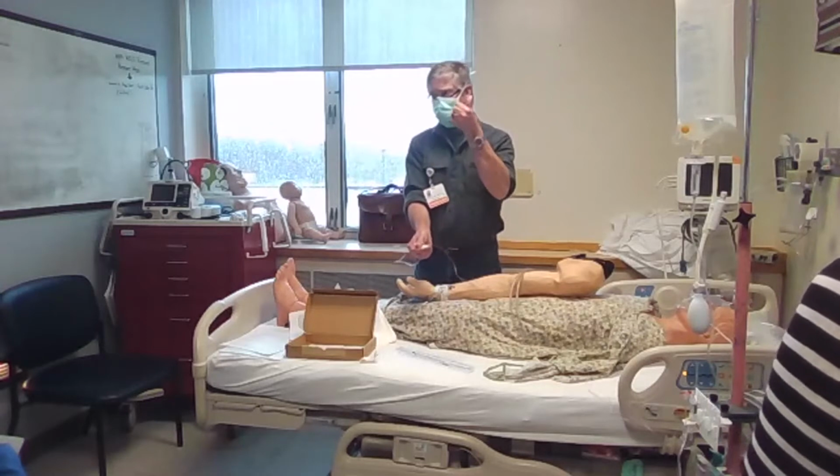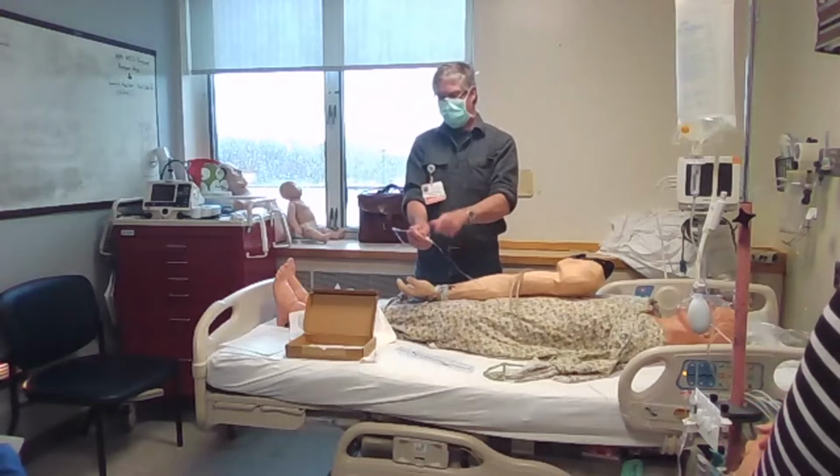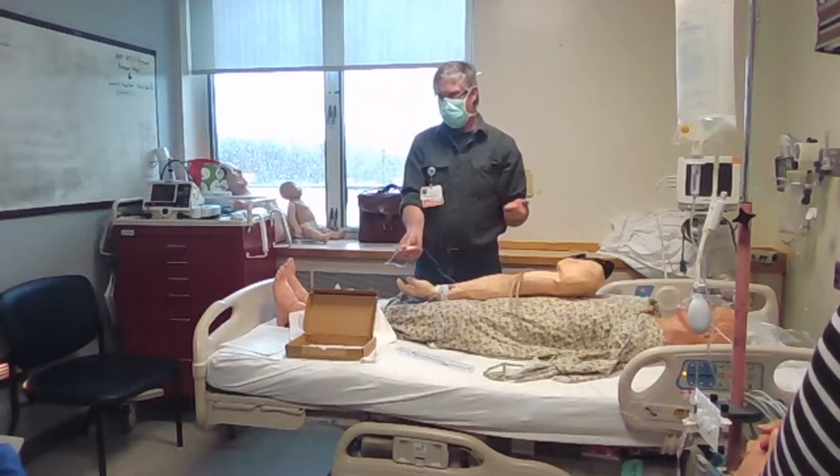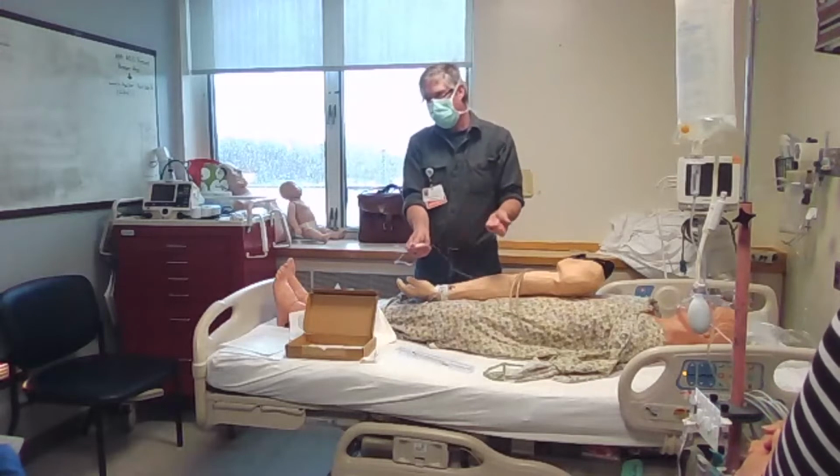It'll just do it all on its own if the patient's got a really good blood pressure. If not, or if it's got a little kink in it somewhere, you're going to pull back on it. If it opens really easily, that's a good thing. If you're sucking on it to try to get it out, something's wrong.